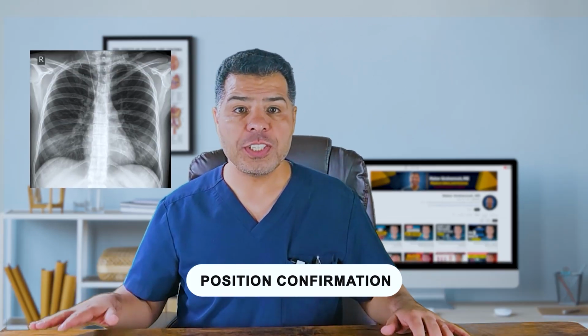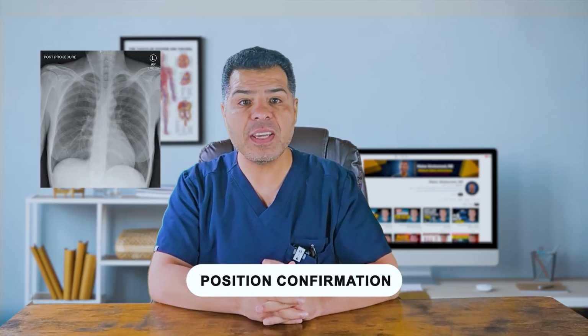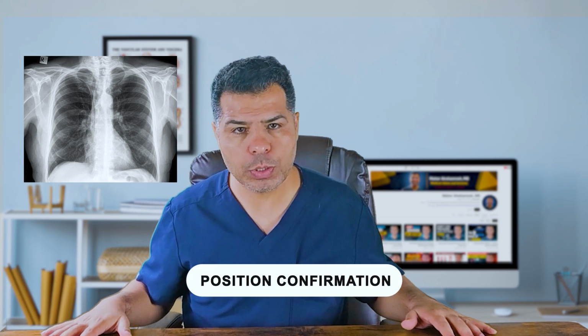Take a look at this chest X-ray. You can see the right IJ in good position here. And here you can see a right IJ temporary dialysis catheter in good position. You see the large bore. And here you see a PICC line also in good position as well.